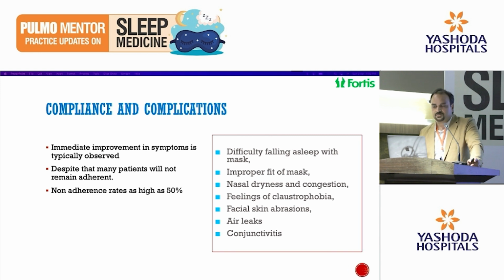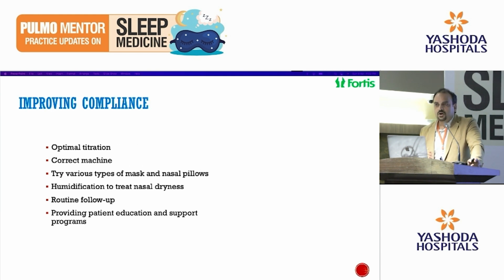And there are many reasons for this. Difficulty falling asleep with the mask, improper fit of the mask, nasal dryness, congestion because of the leakage, feeling of claustrophobia in some patients, especially females, facial skin abrasion if the patient is not properly putting on the mask, air leak, and conjunctivitis. So how do you improve this compliance?